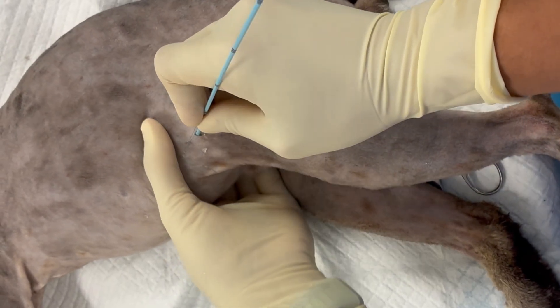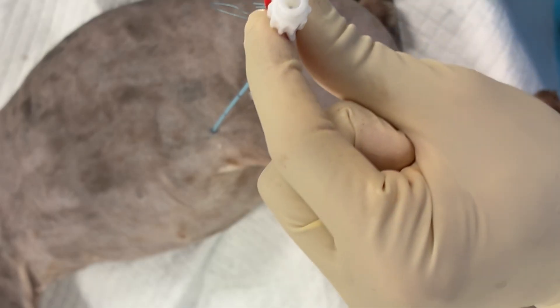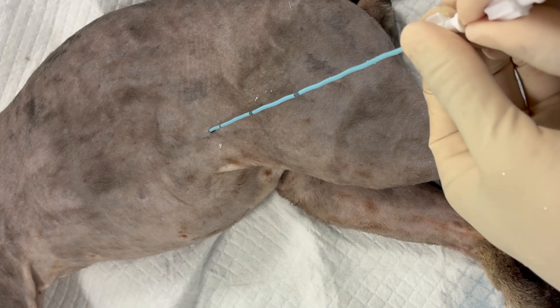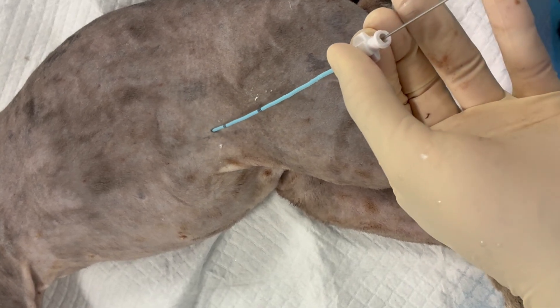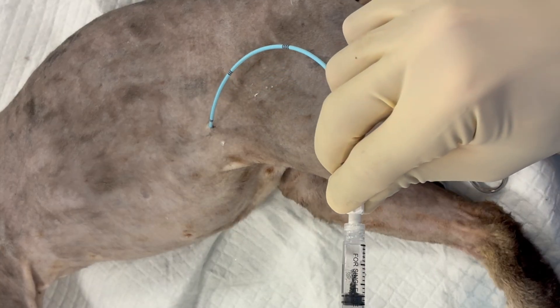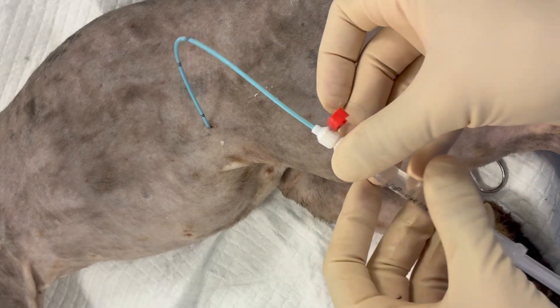Then, with the pigtail, we're going to push that through into the bladder. We'll remove the needle, disconnect the cannula, and then slide the pigtail off of the cannula further into the bladder. Then remove the cannula. Verify entry into the bladder with aspiration of urine.